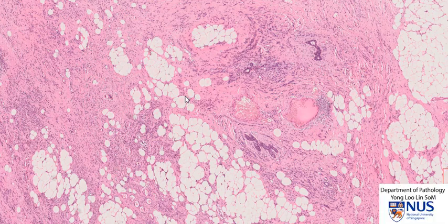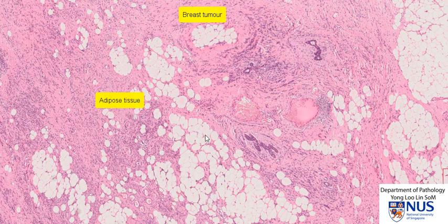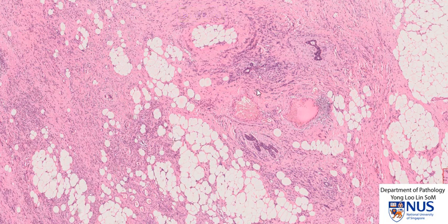Hello, this is a virtual microscopy slide taken from a resection of a breast tumour. We can see at low power that there is some adipose tissue, these whitish areas, and these pinkish areas represent the fibrous stroma of the breast.